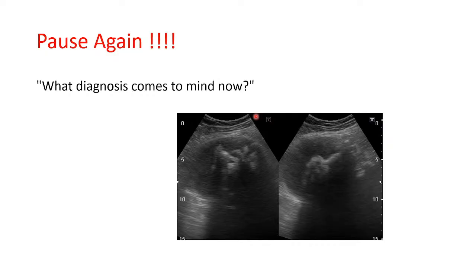So pause again. What diagnosis came to your mind? Look at the lesion nicely again. What are you going to report? You are the sonographer, the radiologist who has done this sonar. How are you going to report it? What do you think this is? Marry this one to the history of the patient. What do you think that could be?